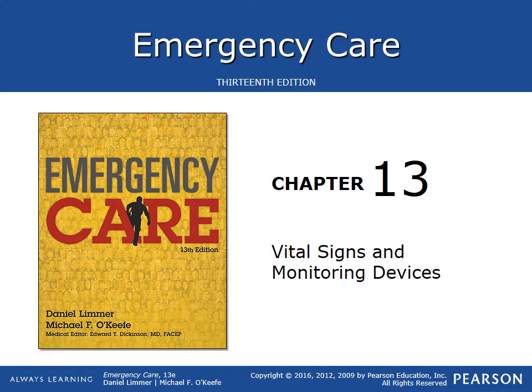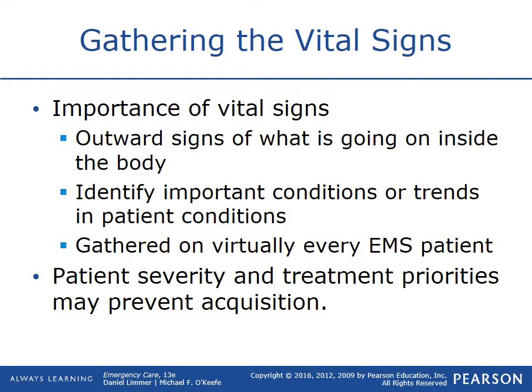Hello everybody. So chapter 13 covers vital signs monitoring devices. We're going to talk about how to get those vital signs such as blood pressure, pulse rates, hooking them up to monitors, getting their blood glucose, getting that full patient report taken care of.